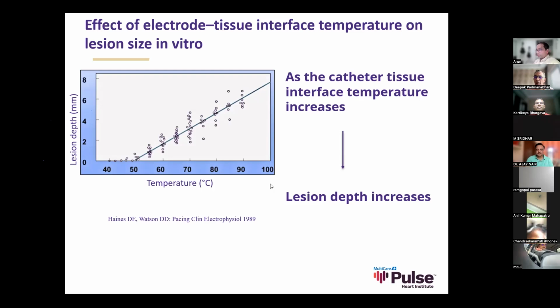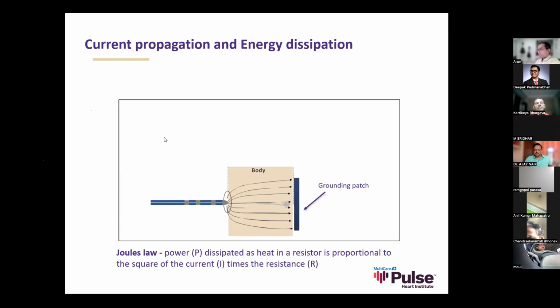This also brings up the point that you definitely need to be in contact. Otherwise, your cooling is going to be entirely different. So all of this is under conditions of contact maintenance. Without contact, you probably don't get to make these interpretations. Even with it, it's pretty complicated. But yes, you have to have contact.